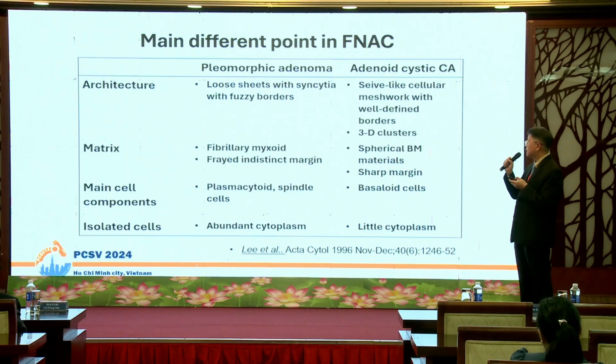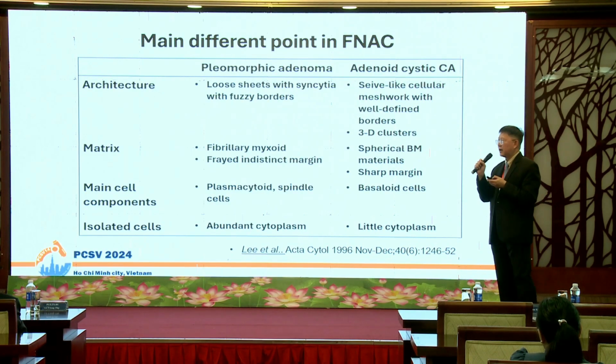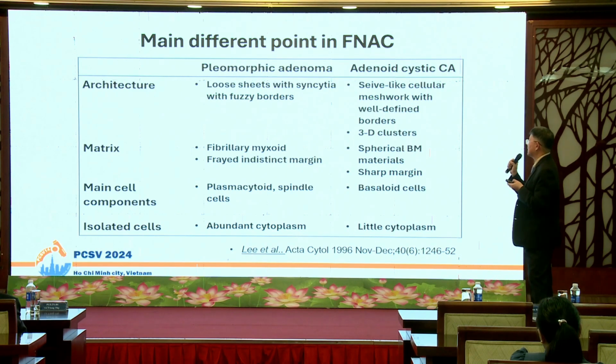So what can we learn from this case? This is the comparison on FNA cytology between pleomorphic adenoma and adenoid cystic carcinoma.